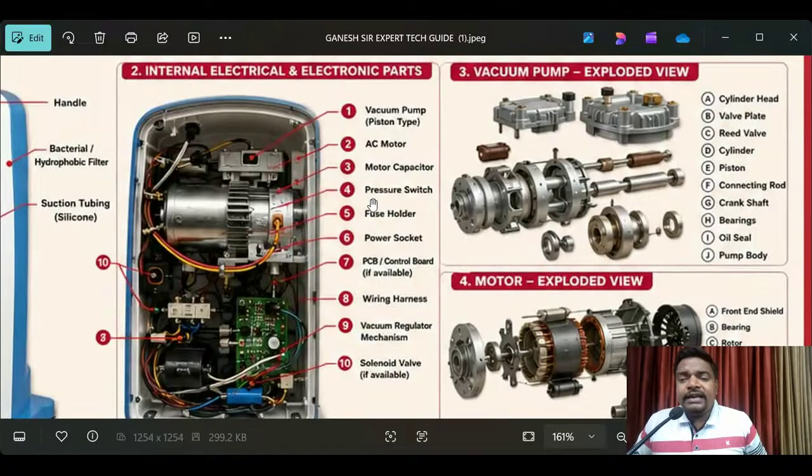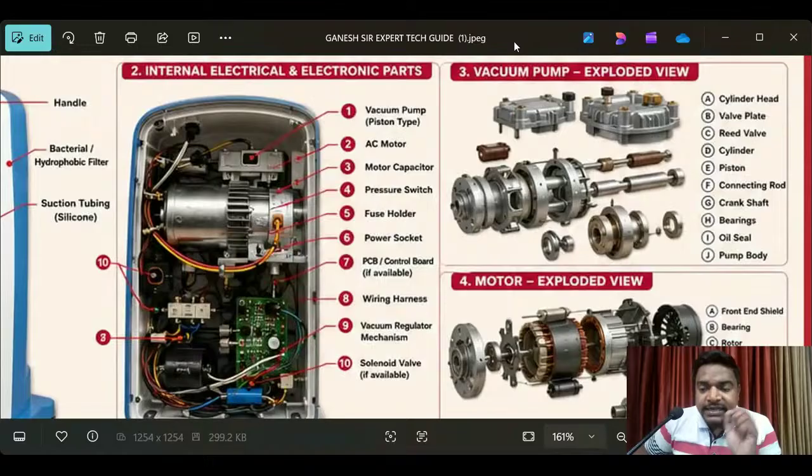So now here, see here, internal view, electronics. See here, pressure switch here, 4C. Fourth point, see here. So it is visible right now, my dear engineers. Listen carefully to what I'm saying here. Because it is visible, it is audible also, because my intention is every information I want to give you in these live sessions.